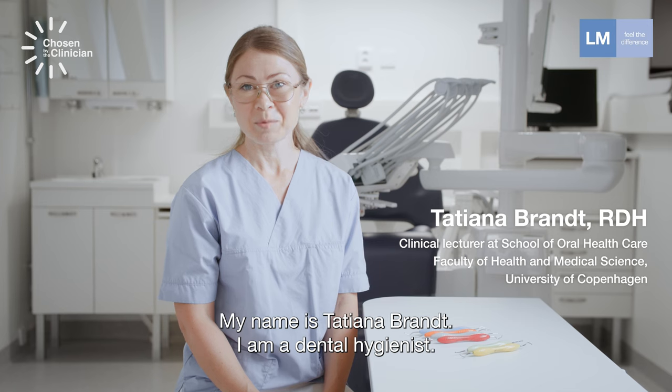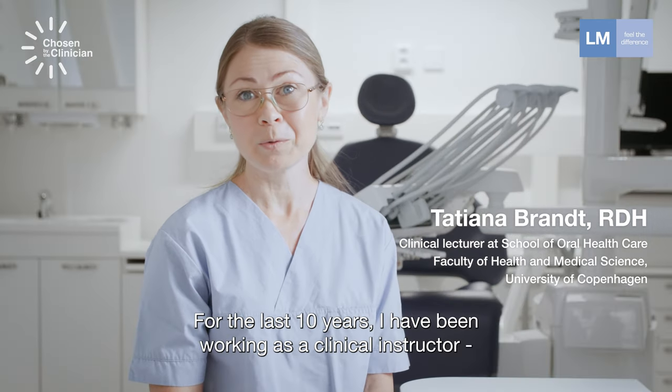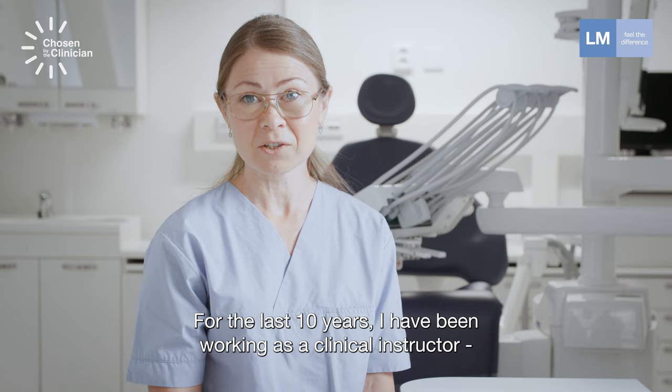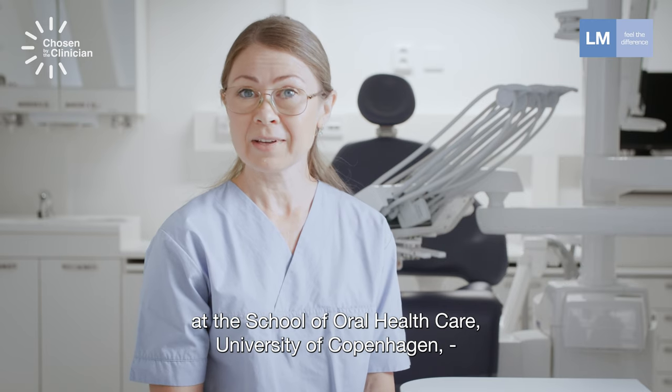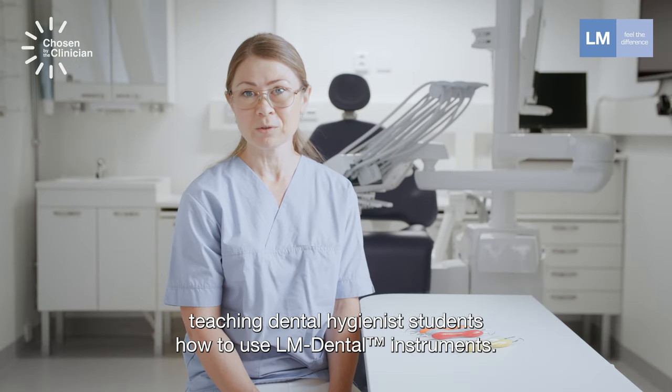My name is Tatiana Brandt. I'm a dental hygienist. For the last 10 years I have been working as a clinical instructor at the School of Oral Health Care, University of Copenhagen, teaching dental hygienist students how to use LM instruments.